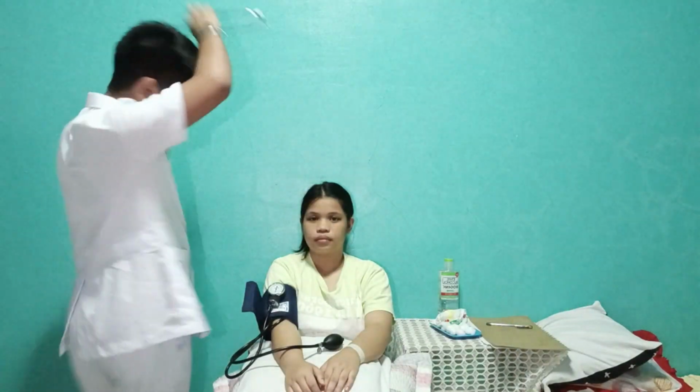For the actual procedure, I'm now going to need to use my stethoscope. But first, I'm going to need to disinfect the earpiece, the diaphragm, and the bell of the stethoscope. For this, I'm going to use the bell part of the stethoscope, because the bell is best used for hearing low pitch sounds.